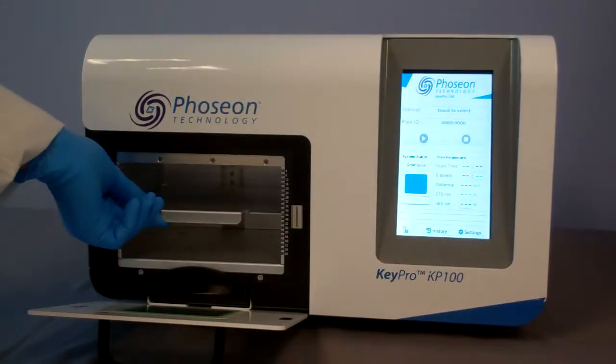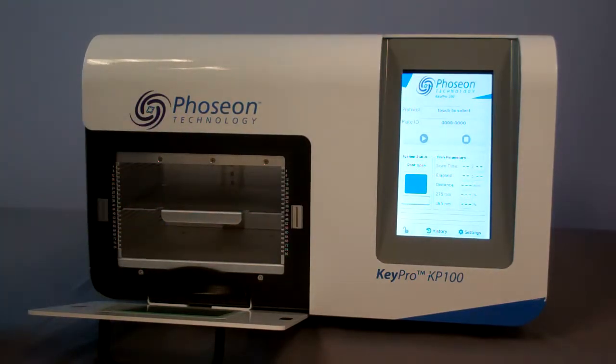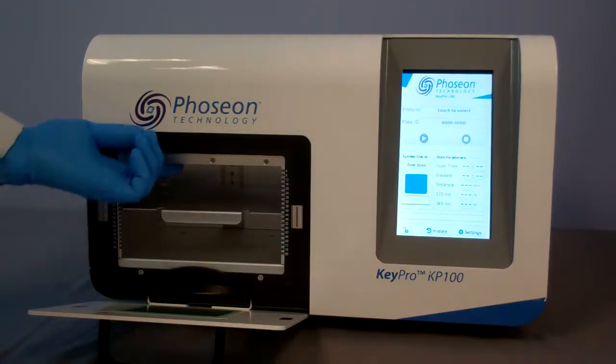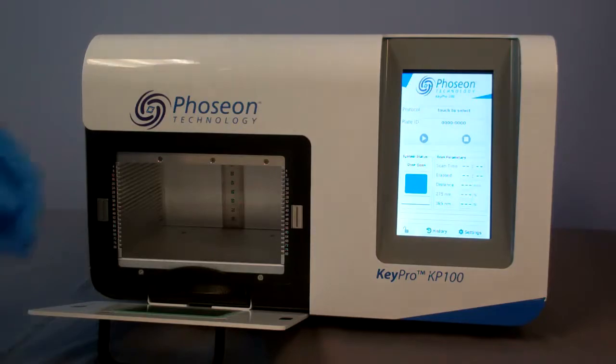The shelf can be inserted into precise grooves on either side of the chamber at 4 mm increments, measured from the emitting window. There's also a ruler guide on the back surface of the chamber to allow the user to visualize the distance of the target surface from the emitting window.